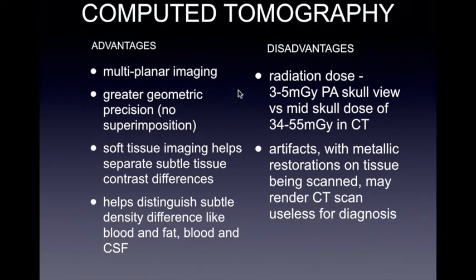But because of how CTs are made, as that advantage of CT scan is there, it has disadvantages. Like what I've said, it re-exposes the same area over and over again. Because in order to get the entire image of the skull, it needs to get a series of layered shots. Remember, the detectors are fixed. The patient is the one that moves across. So areas that are not exposed to the detector's line of sight will have to be retaken in order to take the entire skull.